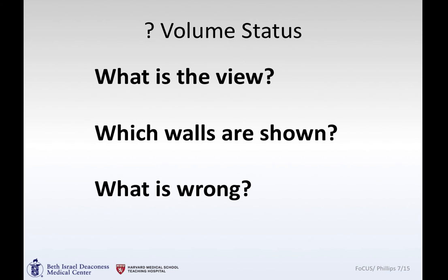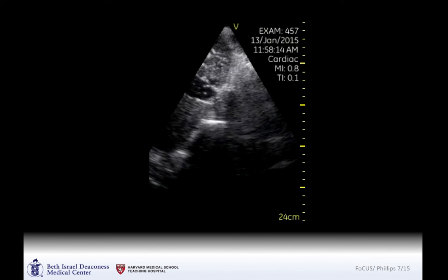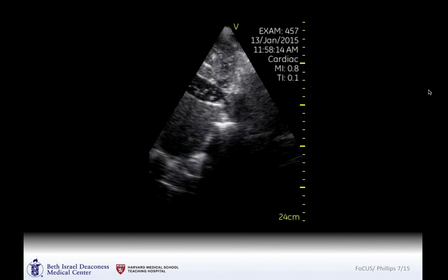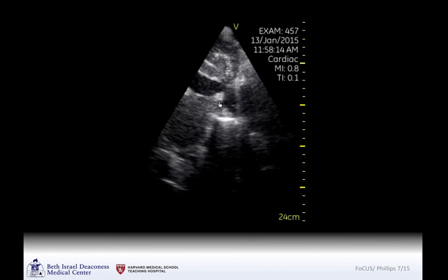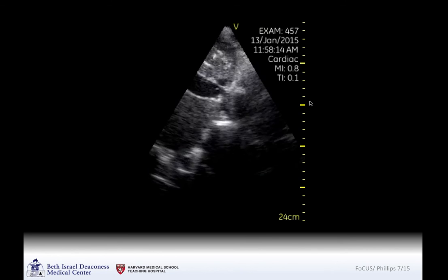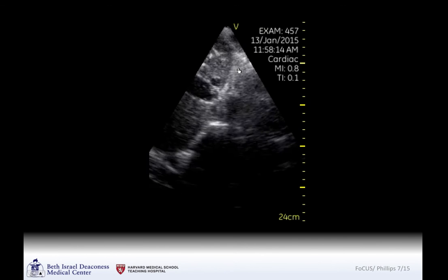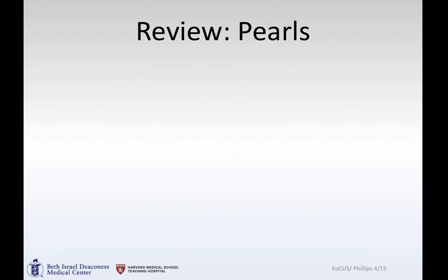Here's a question of volume status. These images were taken during a code — a subcostal view that was then rotated slightly, showing the IVC with hepatic vein filling. You can see agitated saline from a fluid bolus coming in from an injection below the diaphragm. Subcostal view, IVC, and bubbles in the IVC representing a fluid bolus during a code.